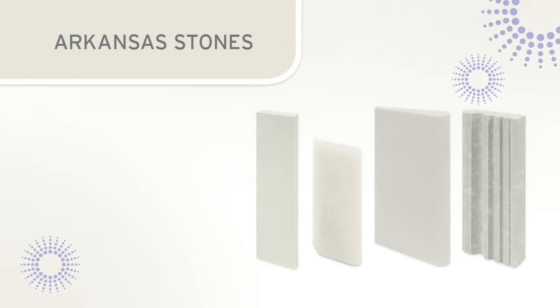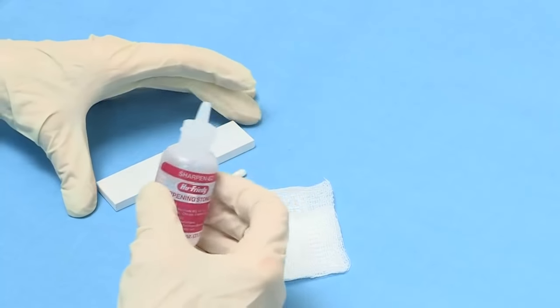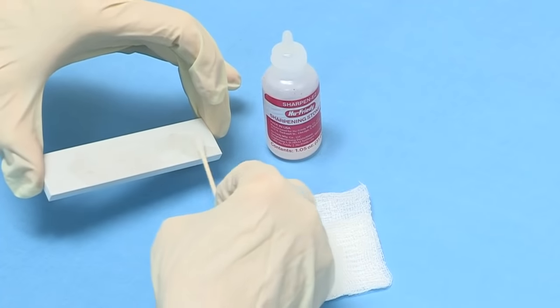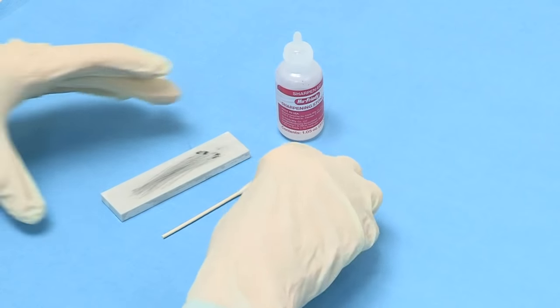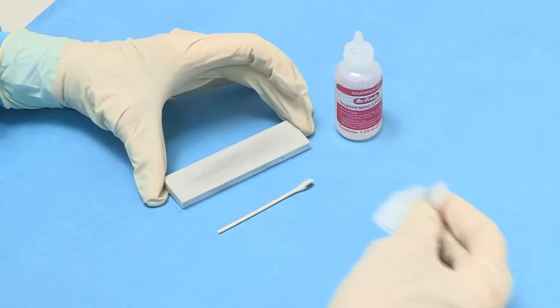Arkansas stones are frequently used to sharpen scalers and curettes. The Arkansas stone is a natural stone with a fine grit, and its color can range from black to gray to a translucent white. When using an Arkansas stone, it is necessary to coat the stone with two or three drops of mineral grade oil. The oil will lubricate the stone and help float away metal shavings, preventing them from becoming embedded in the stone. The buildup of oil and metal shavings that results from sharpening is called sludge, which should be periodically removed with gauze.